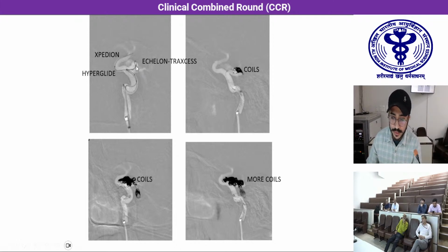After cannulating the aneurysm, we coiled the aneurysm site as well as the IPS and the cavernous sinus as well, thereby eliminating the aneurysm, IPS and superior ophthalmic flow at the same time.